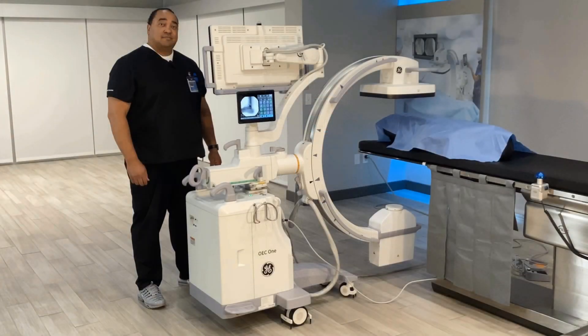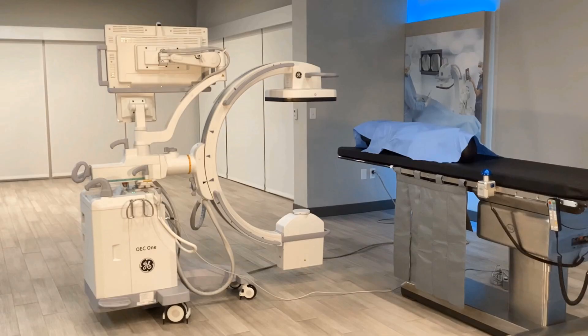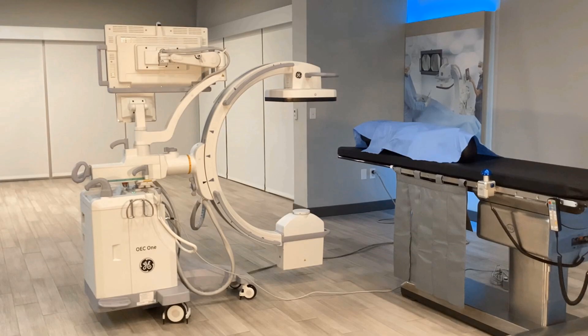Hello, my name is Kevin Holland and I am a clinical imaging specialist with GE Healthcare. And I am Allison Cook. This video will discuss OEC1 CFD brakes.